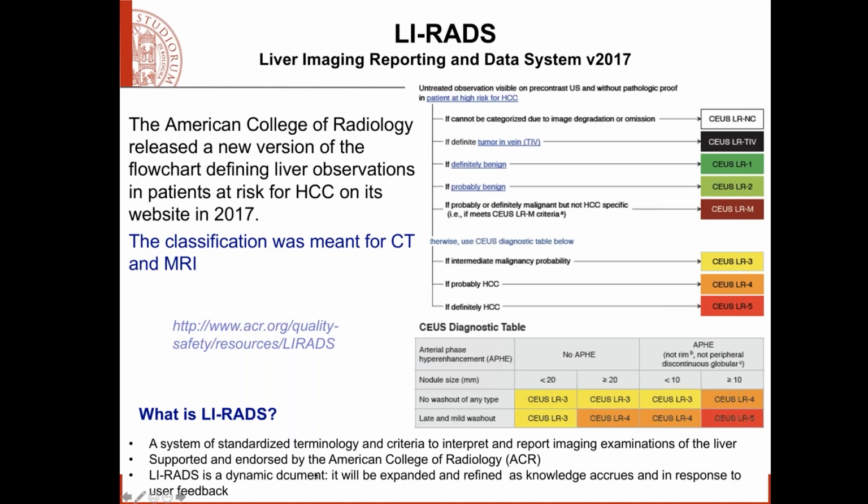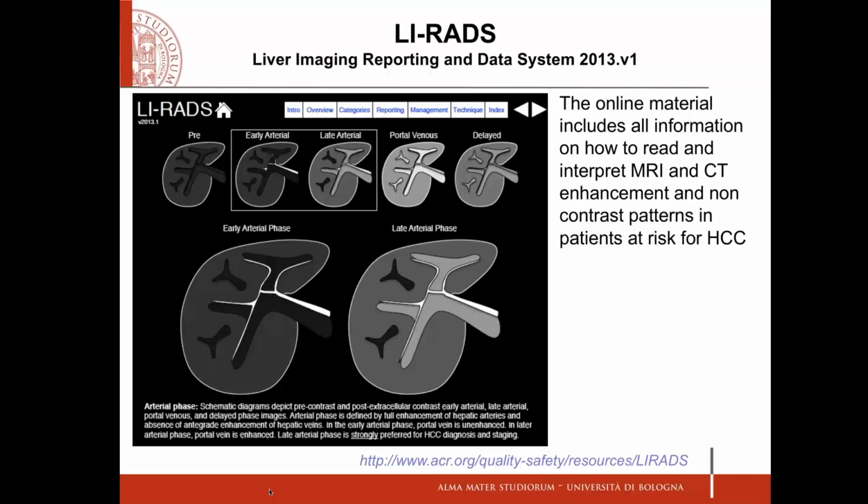Wash in followed by washout, hypoechoic appearance, whether it is only when it becomes less echoic than before or less echoic than the surrounding parenchyma. So there was a need for standardization. And this was supported and promoted by the American College of Radiology. And every year or every 2 years, it is updated as it is a dynamic document. And currently, we are working on the manual of the CEUS LI-RADS 2020 edition that will come soon.